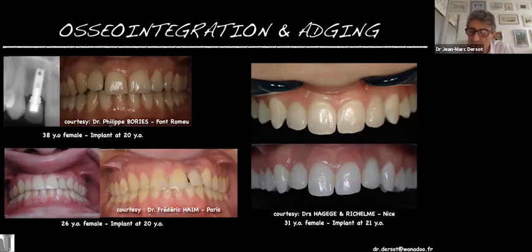Just have a look 10 years after. The implants were inserted when she was 21, and now she is 31. So we are 10 years after. You can see that there is a huge vertical discrepancy, maybe about 2 millimeters, but have a look at the buccal aspect of the two implants. The connective tissue graft has totally disappeared, and we can imagine that we now have a concavity on the buccal aspect of the two implants. I recently spoke by phone with the perio from Nice, and he told me that they took the crowns out. He did a second perio surgery just to have connective tissue on the buccal aspect of the two implants, and they made two new crowns 10 years after.